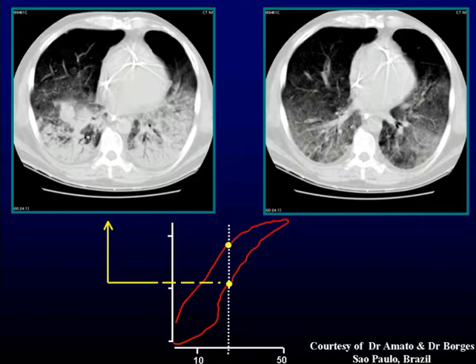The point on the inflation limb, which you can see is a little bit above the so-called inflection point, is showing a huge amount of collapse, and I must remind you that this has always been said to reflect the PEEP level that is preventing collapse in the patient's lungs. But the amount of collapse is just amazing. The same pressure point, but on the deflation limb of the relation, is showing a much better aerated lung, and I think the images speak for themselves. We're ventilating the lung in a much better volume-pressure relationship at this site.